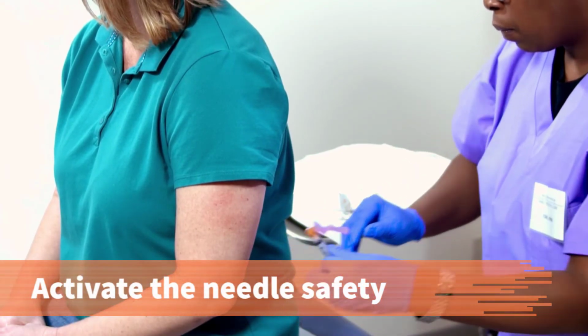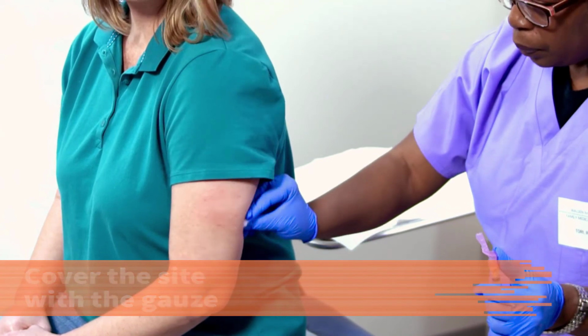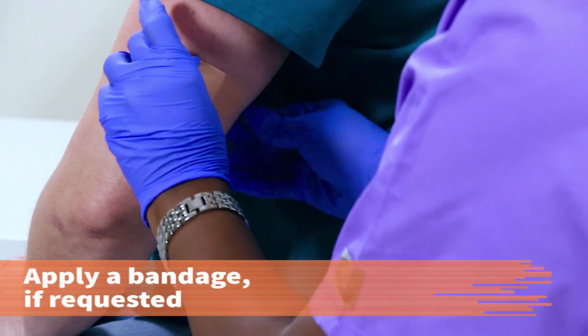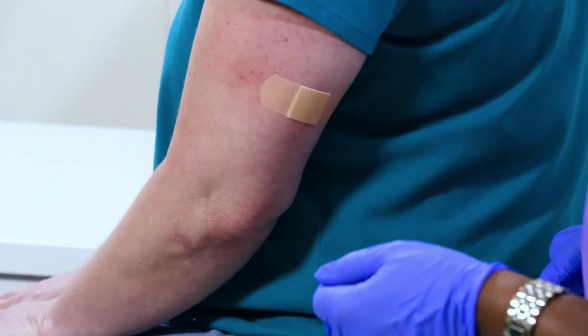Activate the needle safety device with one hand while the other hand covers the site with gauze or a cotton ball. Gently apply pressure at the site to stop any bleeding. Apply a bandage if the patient requests it. Remember that some bandages may contain latex, which can be an allergen to some people.